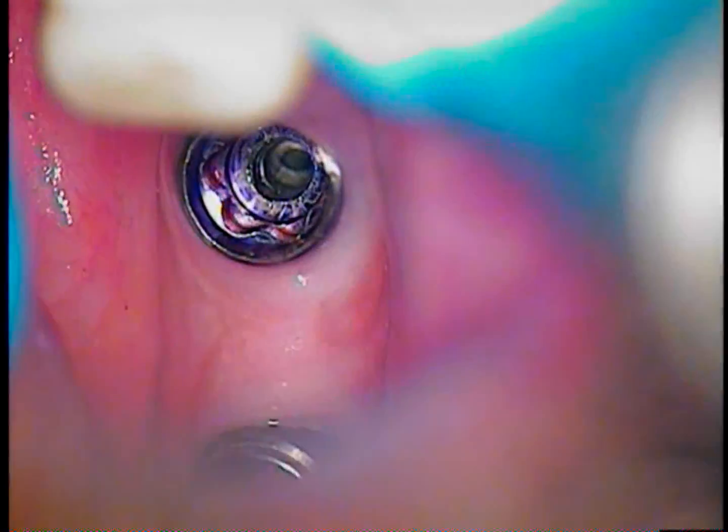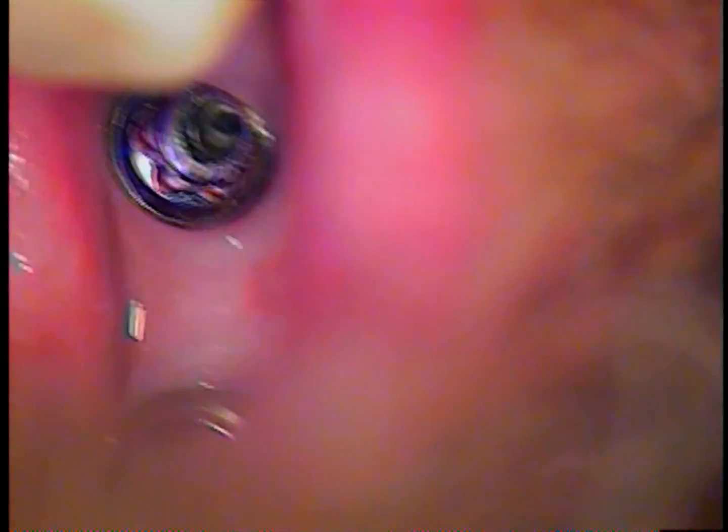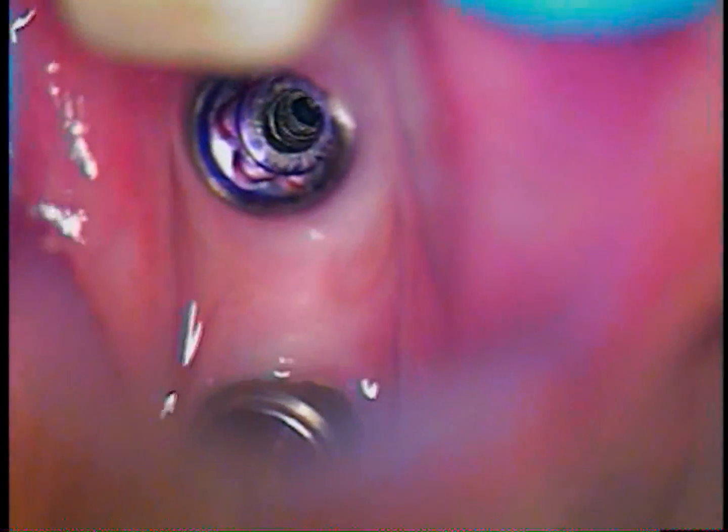And what's probably preventing it from coming up right now, now I'm going back and forth, is the top threads are marred and so it won't just come straight out, won't just move in reverse mode and come out. So another attempt with the driver. So it's flat slot and flat driver to the slot. Now we're just turning it, see if it would continue to show movement, which is wonderful.